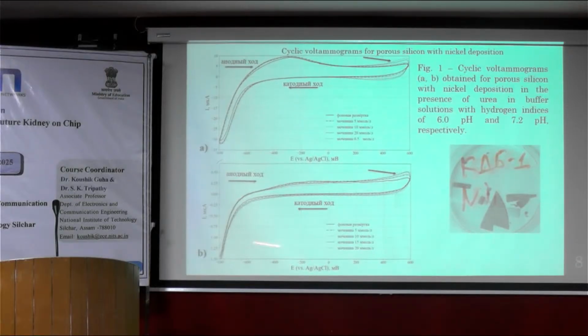And another problem is the blood compatibility of the electrode. So we need to acquire the type of electrode that will be basically hemocompatible. And that's another issue with cyclic voltammetry, because since we change the potential of the electrode, there is a big chance that at some point we will interact with the components of the blood.